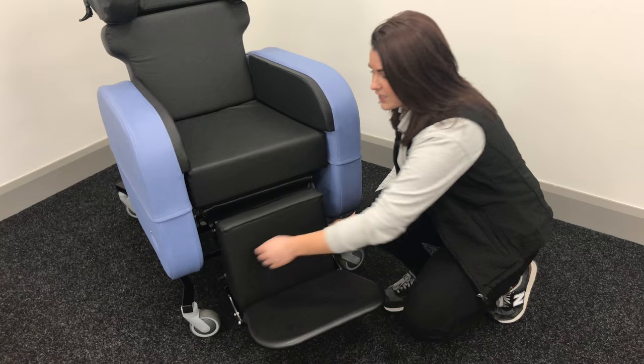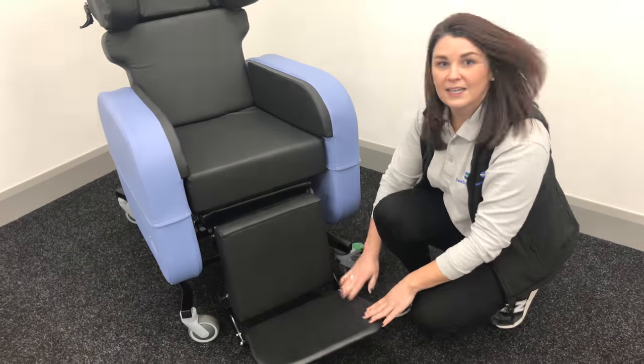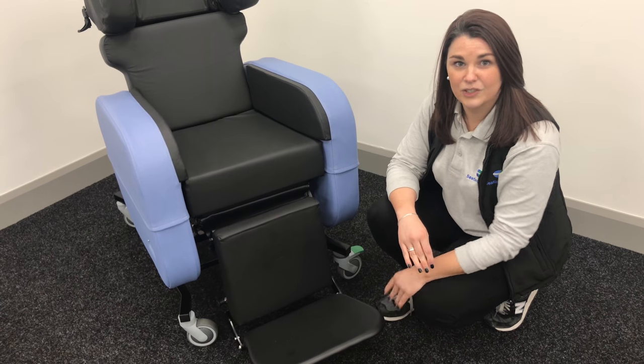And if you need to lower the foot plate down again, just pull those out, get the right height, and that's the foot plate in a new position.